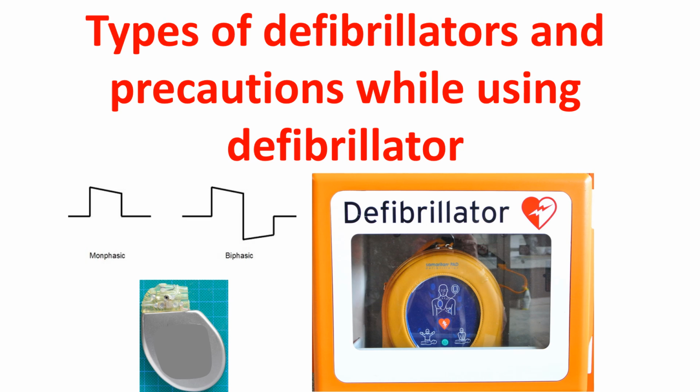A defibrillator is a device used to deliver a high voltage direct current shock to the chest through a pair of electrode patches or paddles to restart the heart which has suffered a cardiac arrest. Usually the voltage is about 2000 volts. A high voltage capacitor is used in the device to store the energy at high voltage just before delivery.